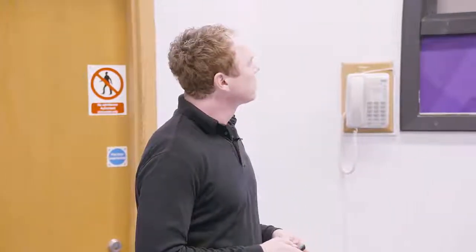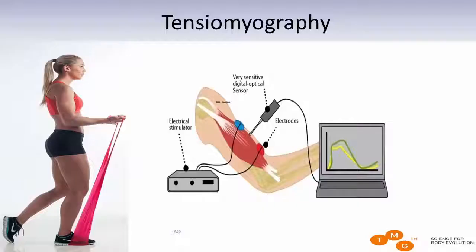Now let's move to the part to actually describe what TMG is all about. So how does it work? What are we actually measuring? This display here is very simplified, so you only have 3 components. We'll start with the thing that we are actually measuring.